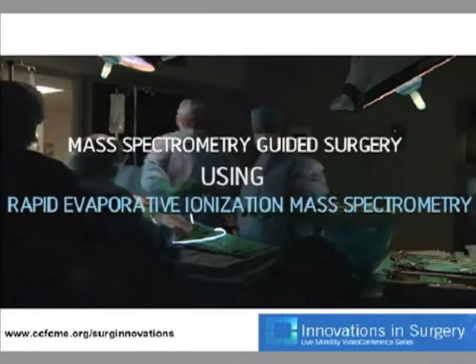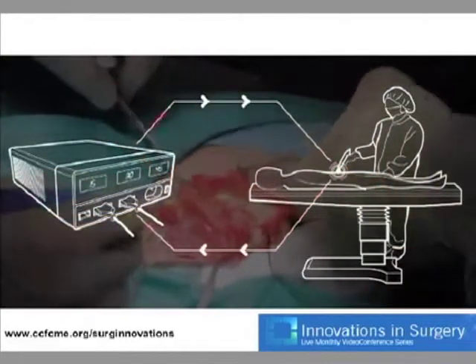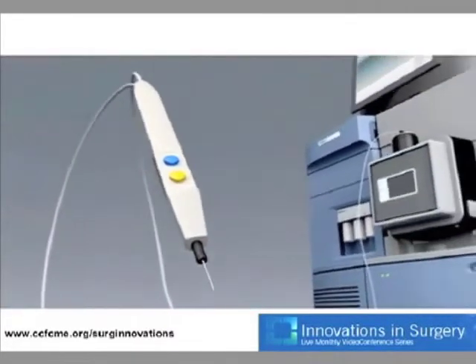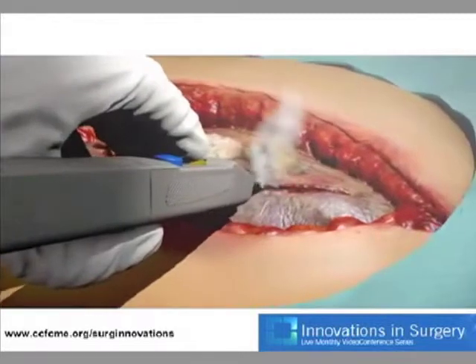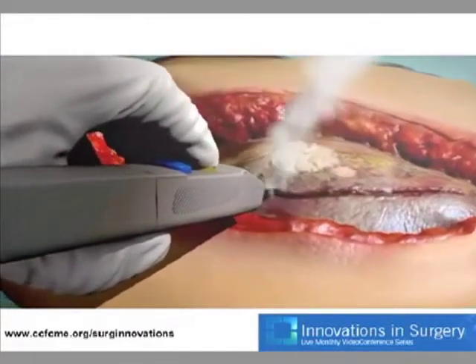The device doesn't really require the surgeon to have any other technology in the operating room that they would normally have. We use standard electrocautery. It can be any instrument that creates heat or energy, because that creates ions, and mass spectrometry senses ions as a function of their mass to charge ratio, and displays that in the spectrum. So we have a little chimney in the device that we've manufactured. Otherwise, it's a completely standard handheld instrument.